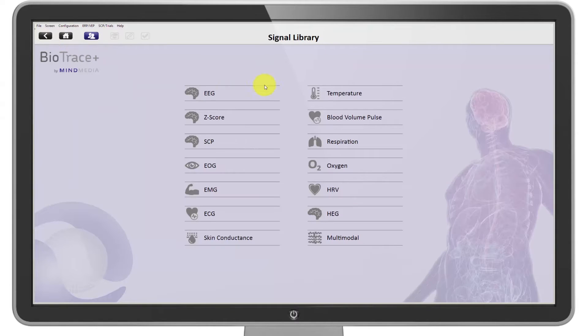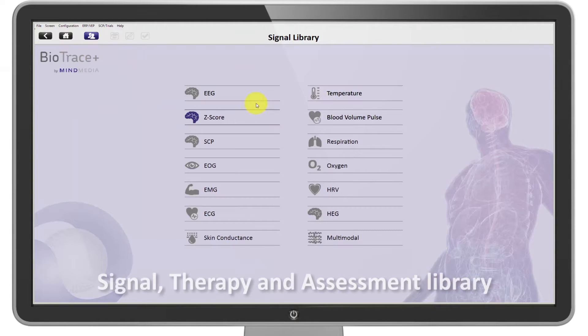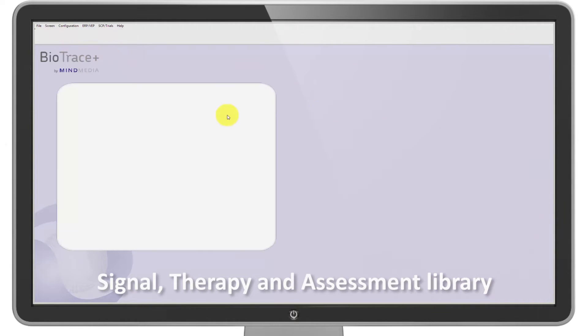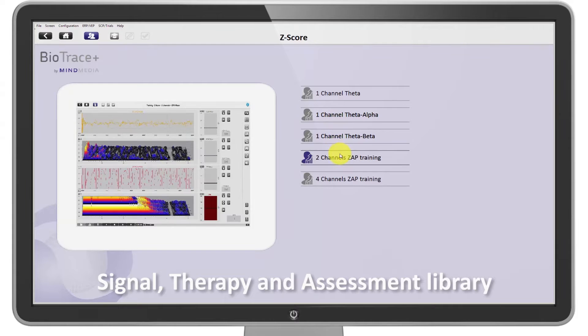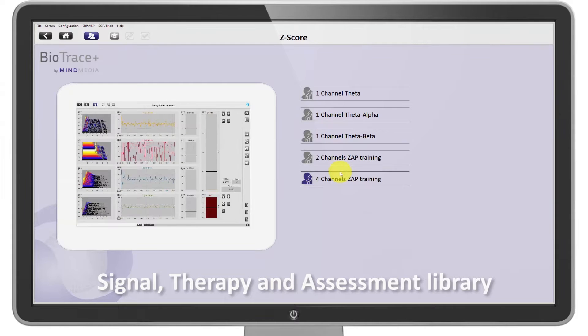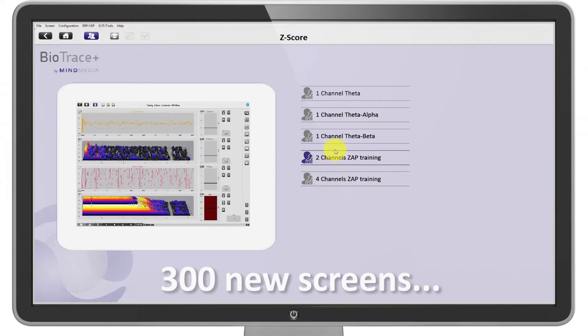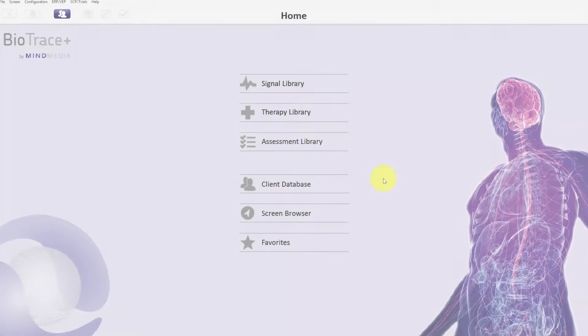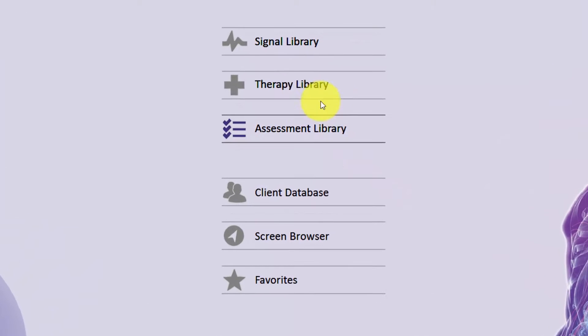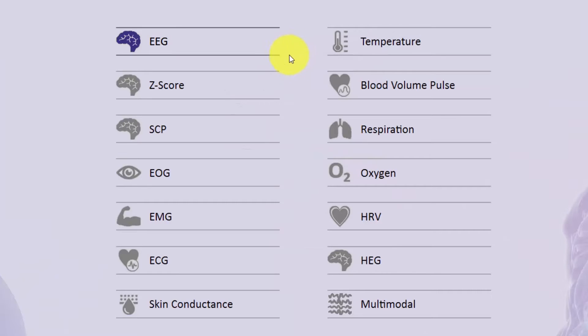BioTrace Plus features a signal library, a therapy library, and assessment library with over 300 new screens. Simply open the signal or application of your choice and get started. It's that easy.